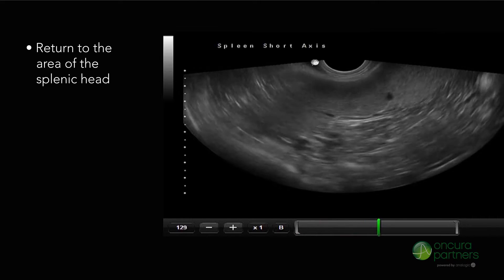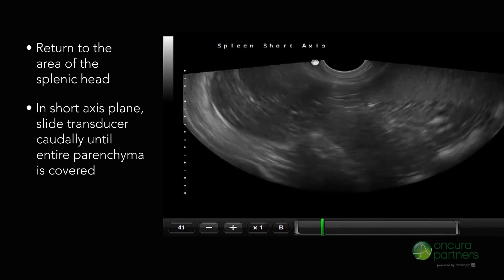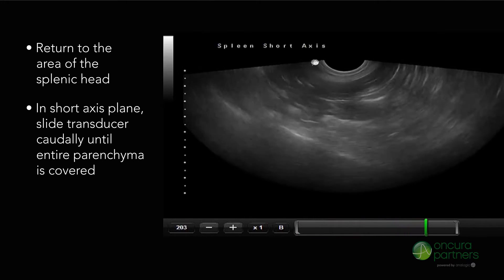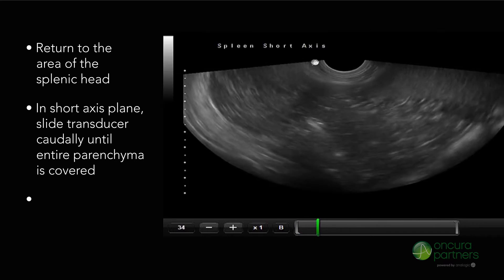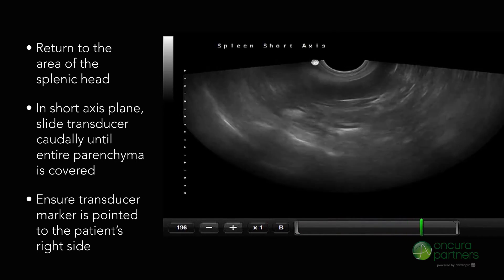Return to the area of the splenic head. In the short axis plane, continue sliding the transducer caudally until the entire parenchyma is covered. Ensure the transducer is pointed to the patient's right side.